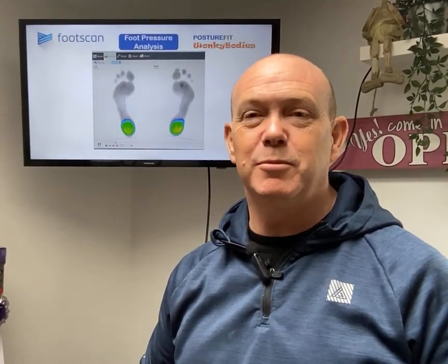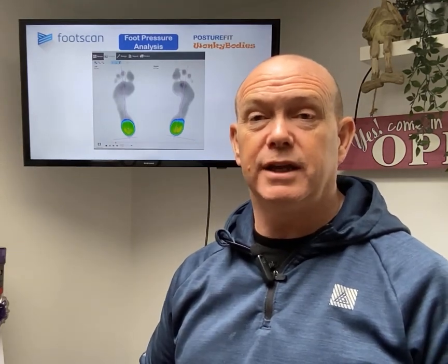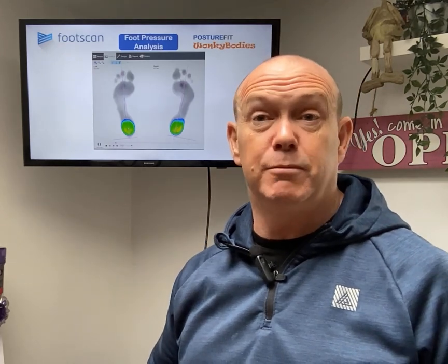I just want to take a moment of your time to talk about Footscan, which is one of the tools we use in clinic, and how we actually use it to analyse people's gait and movement and postures.